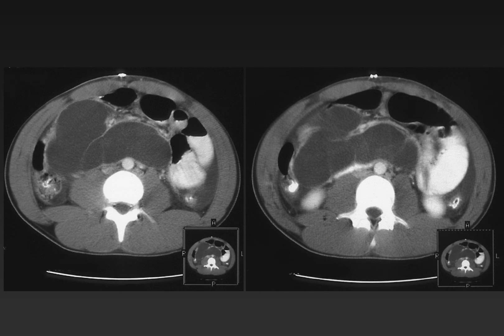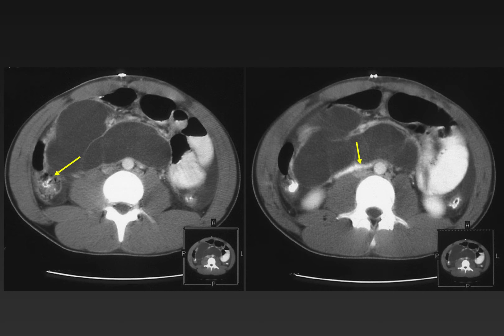On initial inspection, the images on this child suggest a closed-loop obstruction. There is contrast material in dilated proximal bowel and a loop of unopacified dilated bowel in the center of the image. However, this cannot be so, since there is contrast in collapsed distal bowel and in the colon. The obstruction was caused by external compression of bowel by a large duplication cyst.